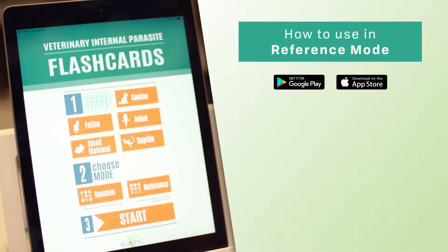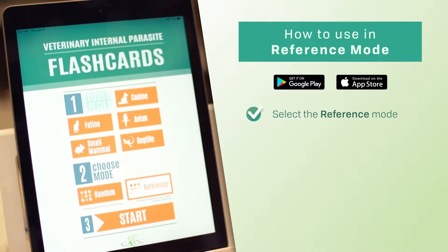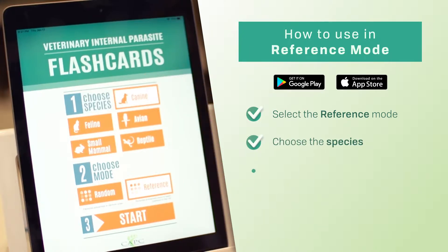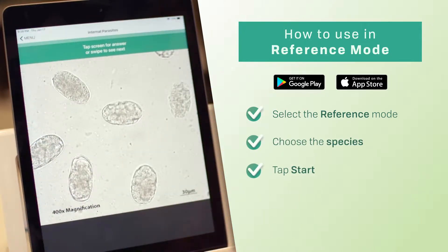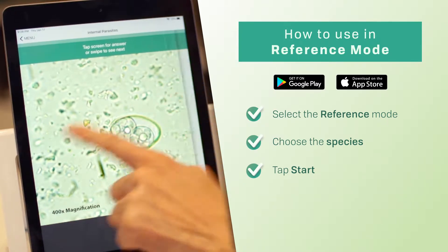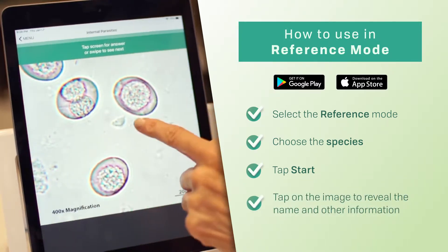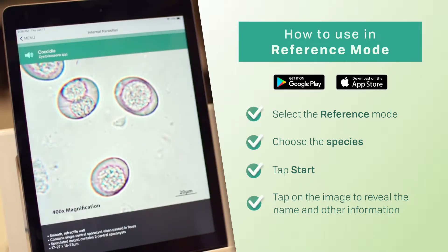First we're going to use the reference tool option. Select Reference Mode — this option is useful when needing guidance while examining fecal samples. Choose a species of animal, then tap Start. Swipe through the images to compare against what you see in the microscope field. When you've found a match, tap on the image to reveal the name and information about the parasite.